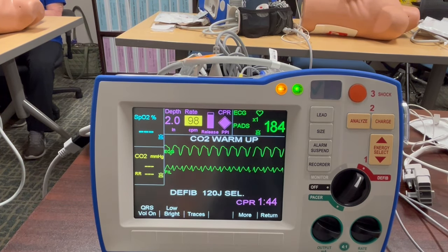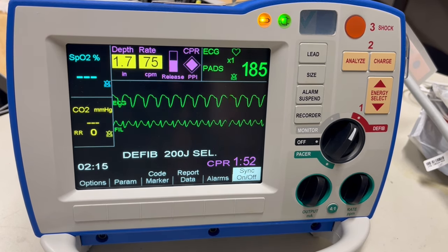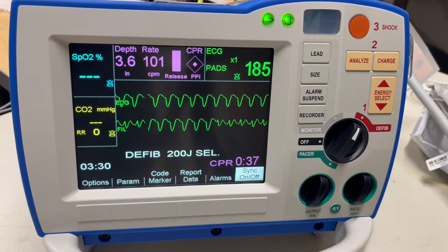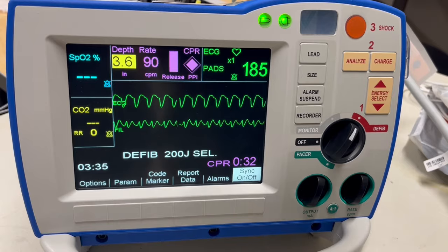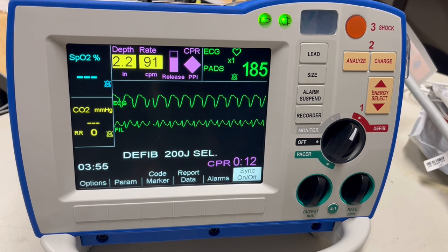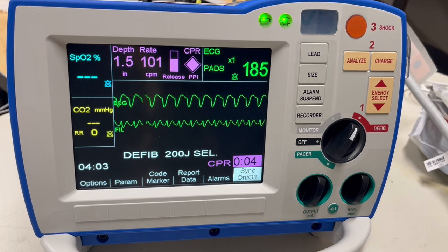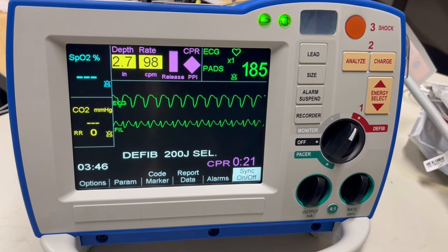If you continue to not go deep enough, you will get a verbal prompt: 'Push harder.' Next you will see rate — the rate needs to be 100 beats per minute. If your CPR rate is off, a metronome will kick in to help you adjust. Next you will see release, which checks for ventricular refill — meaning you need to fully compress to a depth of 2 inches and then fully release to allow the ventricles to fill up with blood. Your goal is to have the whole rectangle solid purple.